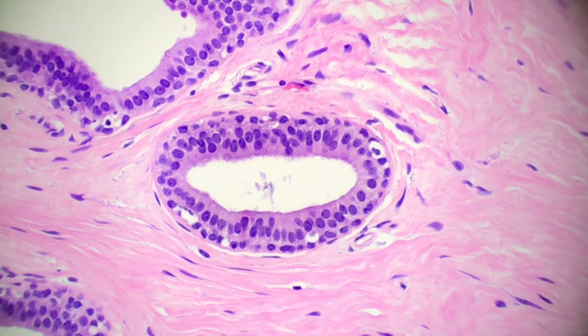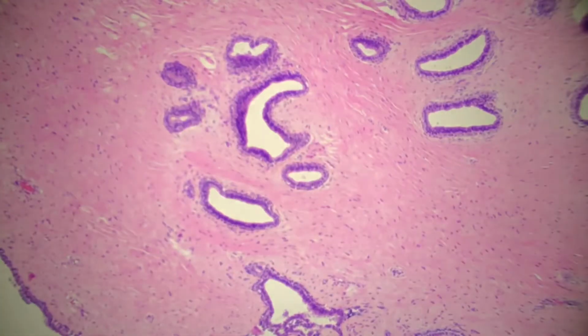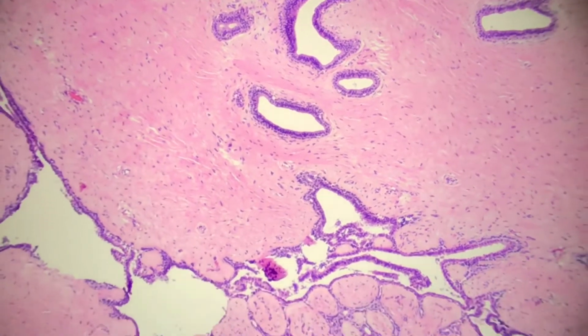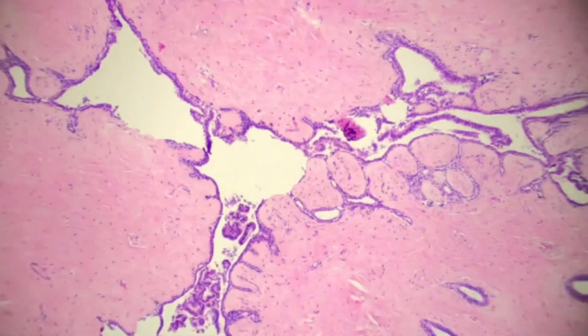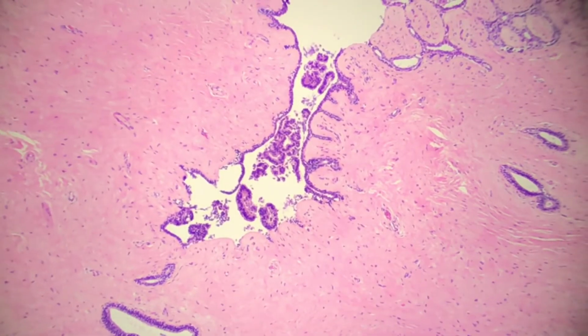Some things that you can also see in this, associated with fibroadenomas is sclerosing adenosis. You can see apocrine metaplasia. You can see squamous metaplasia. And you can also see UDH, or usual ductal hyperplasia. What this case has, that's a little interesting, and some of you might have seen it as I was driving around, we'll go back to a good place, is that it has a bit of a papillary component.